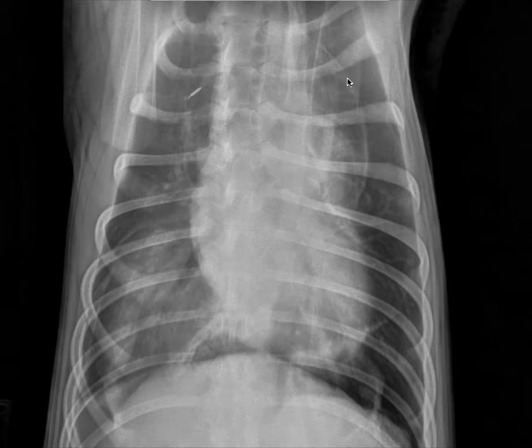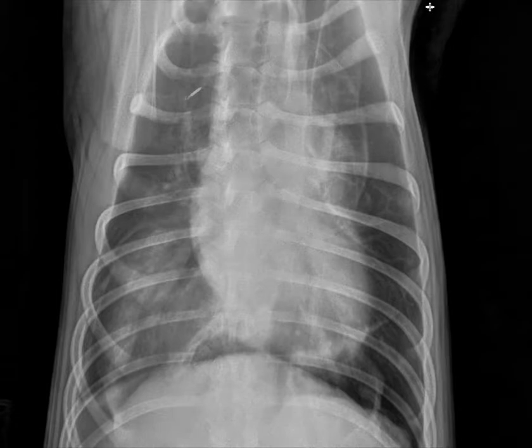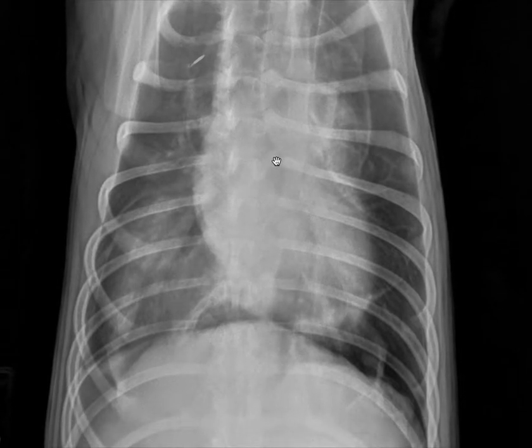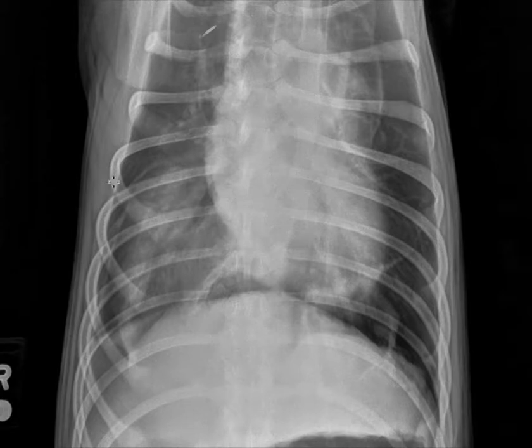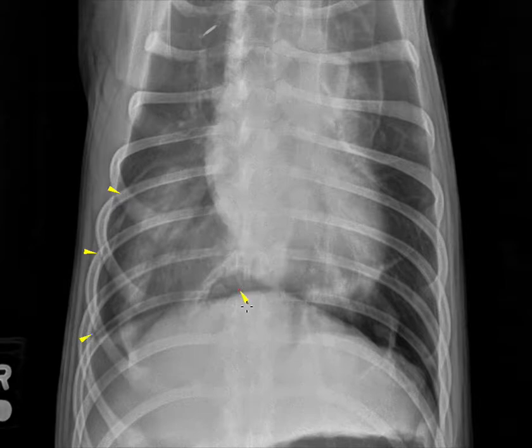Many of you have already commented that you see an alveolar pattern. I actually agree that an alveolar pattern is present, however it's not the only pattern that's present. So for those of you that said interstitial, you're right too. Let's get into this case so we can understand how it's possible that we can all be right. Double kudos to those who said alveolar, because that's how I would have characterized this one also, despite the fact that there's more than one pattern present.